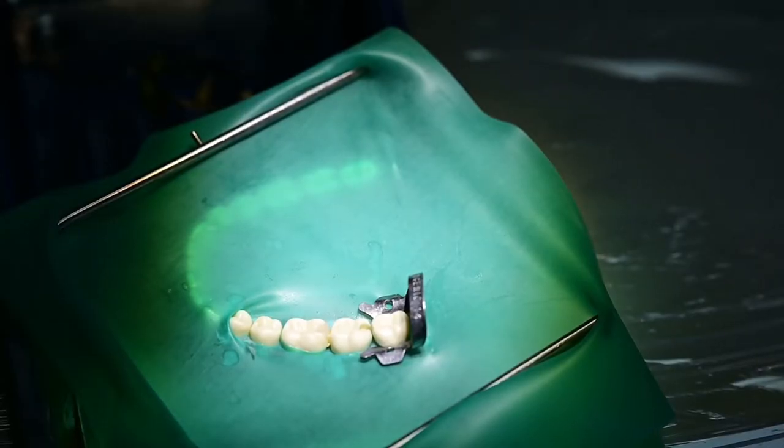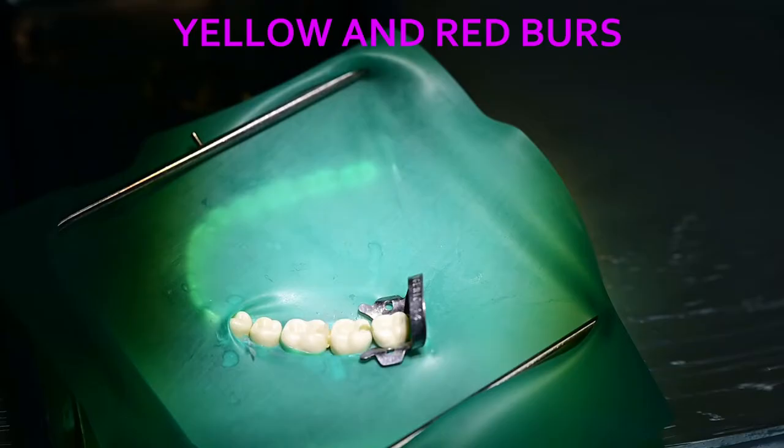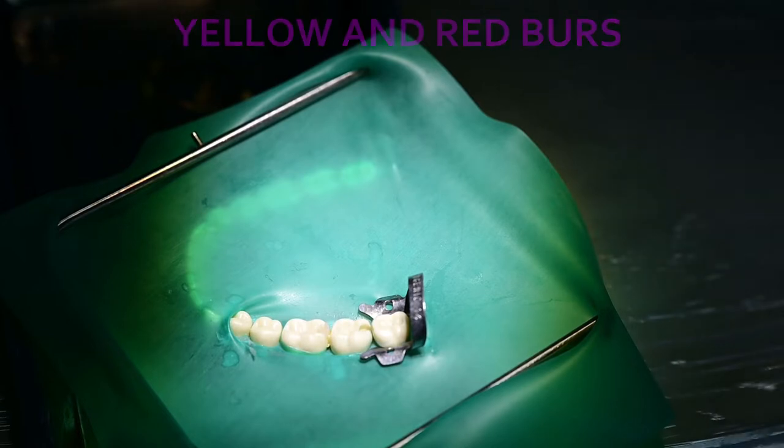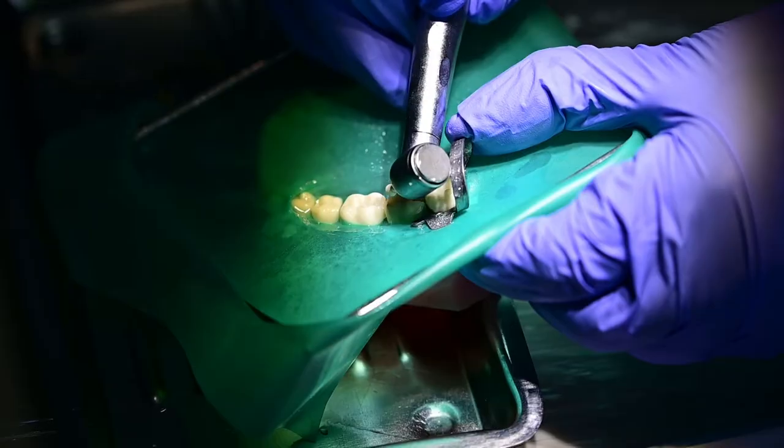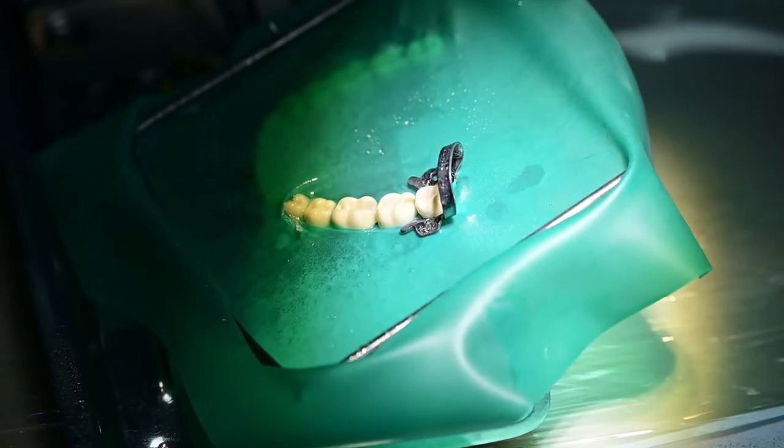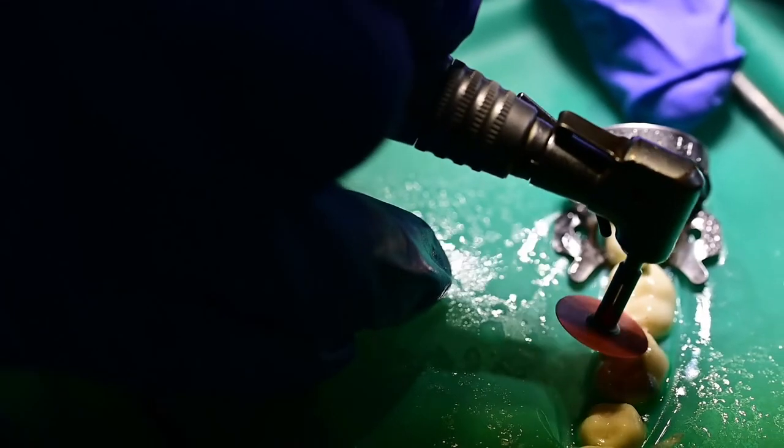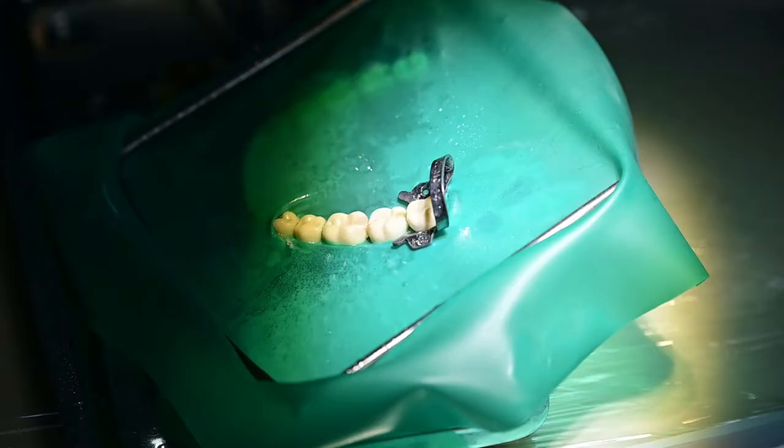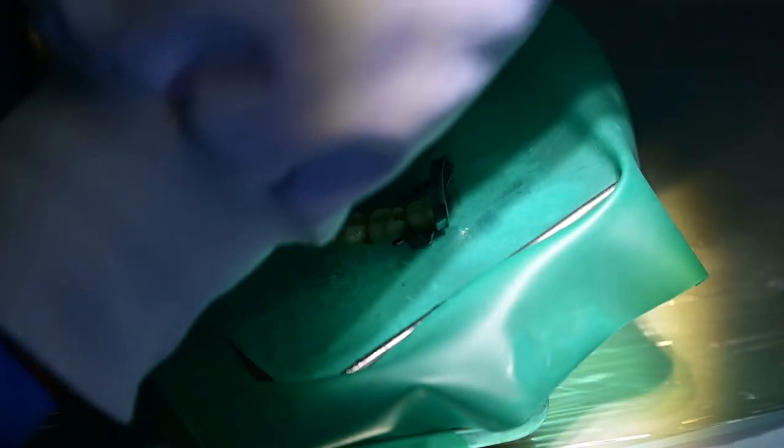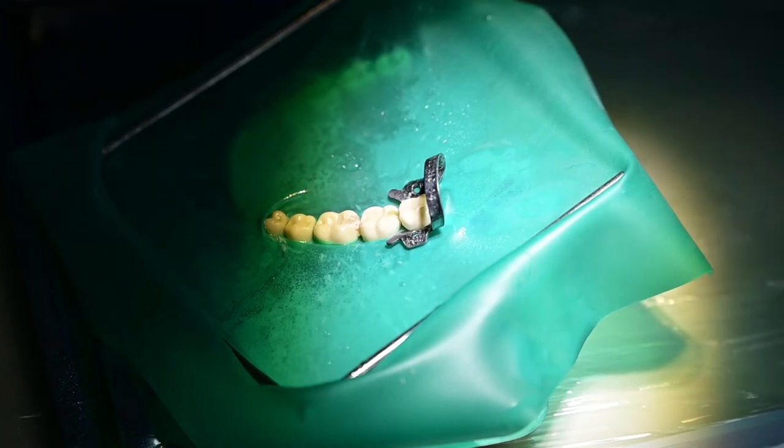The final step is to now finish the restoration. As I said in the beginning, we want smooth burs like the red collar bur. And then we remove the excess. And thereafter polish it with Sof-Lex discs. And I can finish with the Sof-Lex discs. Then I move now to the next coarseness which is smoother than the one I was using. Don't need water for the Sof-Lex stage. And then I am on the second last.